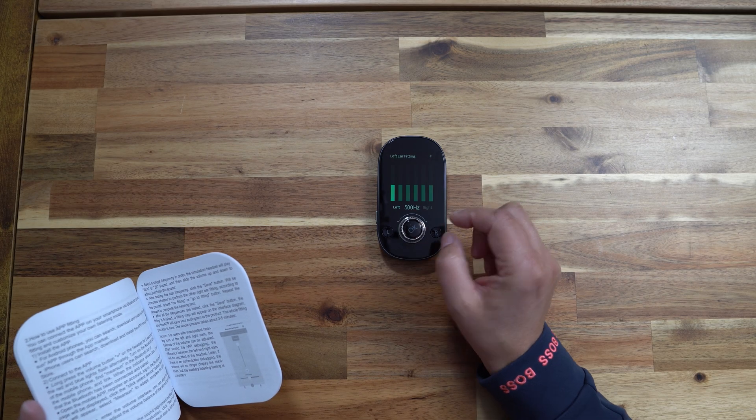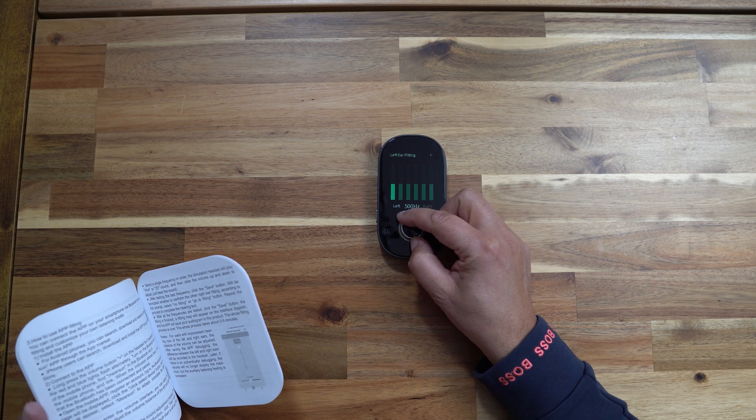Let's break down the key features of the Mearsan hearing aid. First, the self-fitting feature uses AI-powered personalization — this is a game changer, as you don't need to visit a doctor or hearing specialist to get these fitted. You do it straight from the app or the fitting device yourself. The hearing aids use a special fitting algorithm based on millions of data points to help users find the perfect hearing settings for their needs, increasing hearing quality recognition by more than 20 percent.